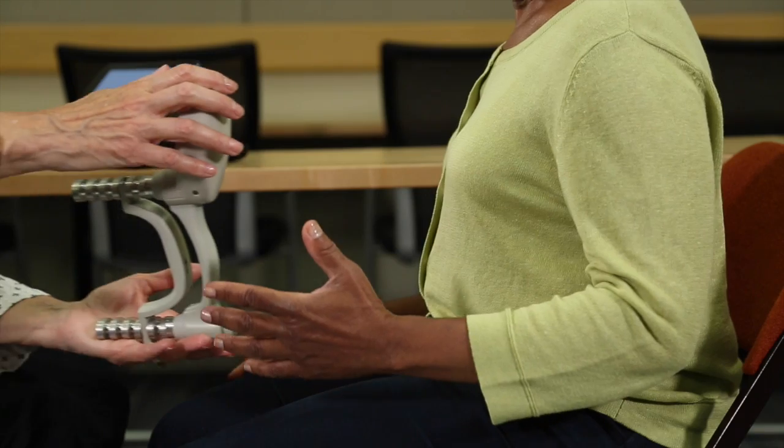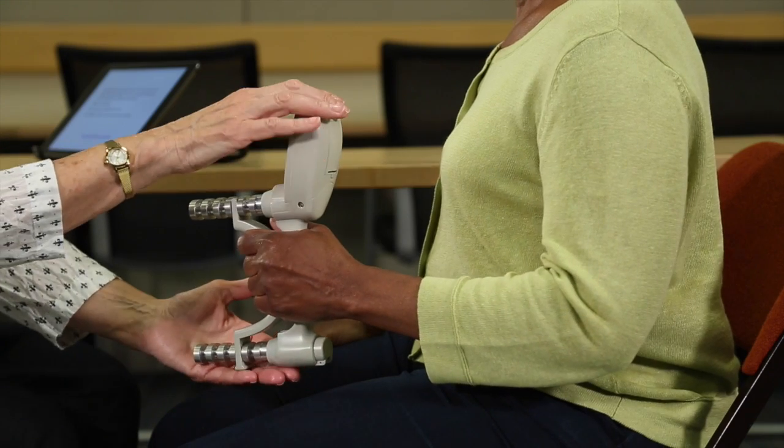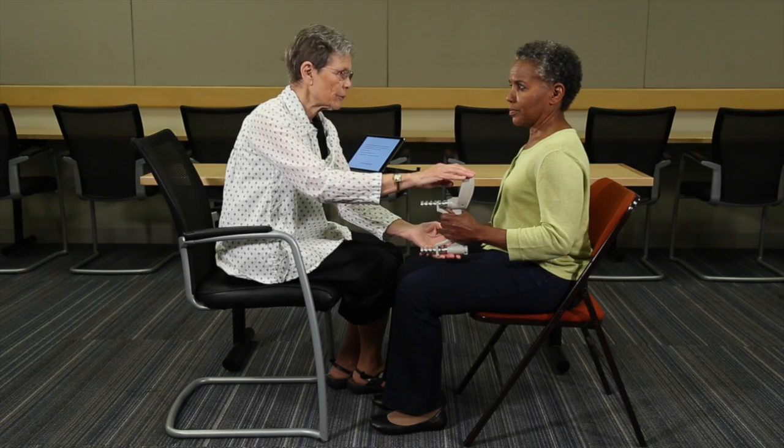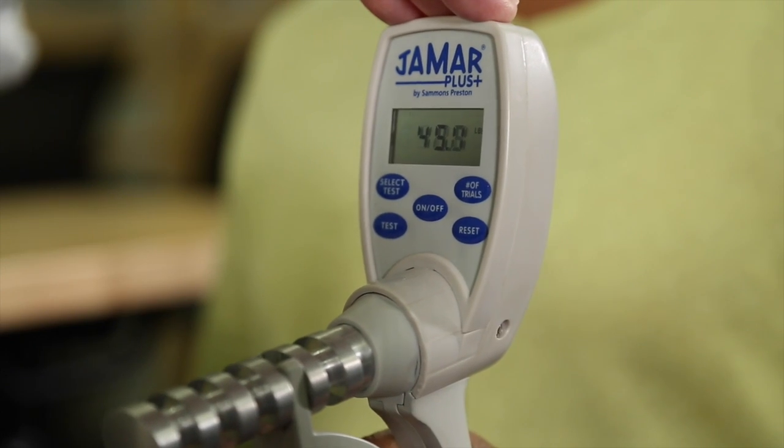No. Okay. Let's practice with your left hand first. All right. When I say squeeze, I want you to squeeze hard, but not as hard as you possibly can. Okay? Okay. So 3, 2, 1, squeeze. Stop. Good job. Now we're going to do the same thing with your right hand.